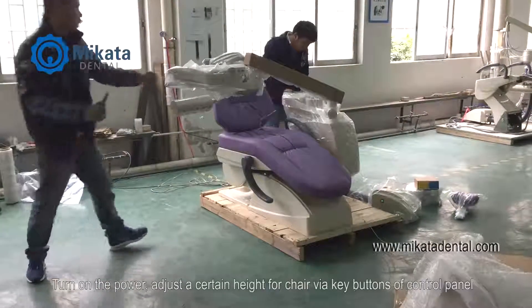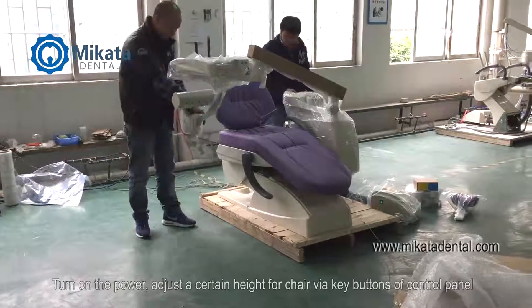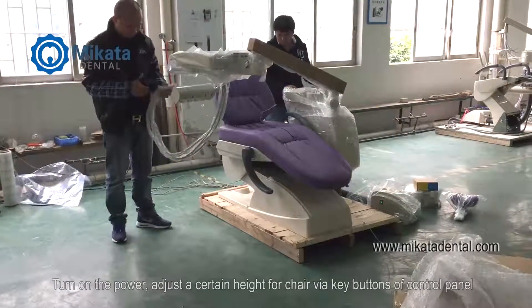Turn on the power. Adjust a certain height for the chair via the key buttons of the control panel.